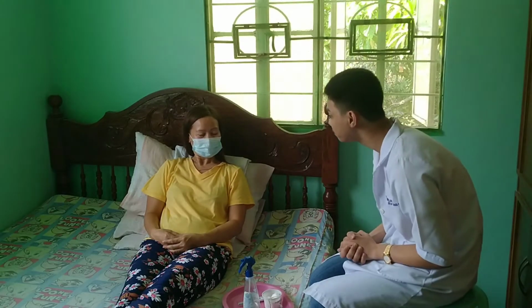Good day, ma'am. I am Vince Gerald M. San Miguel, a nursing student from Nueva Ecija University of Science and Technology, batch 24. Magpe-perform lamang po ako ngayon sa inyo ng vital signs. Ano po pala yung pangalan niyo, ma'am? Geraldine San Miguel, nurse. Ilang taon na po kayo? 45. So, yung vital signs po natin ngayon na kukunin po sa inyo is yung pulse rate niyo po, yung respiration niyo po, and yung temperature niyo po. Okay lang po ba yun, ma'am?